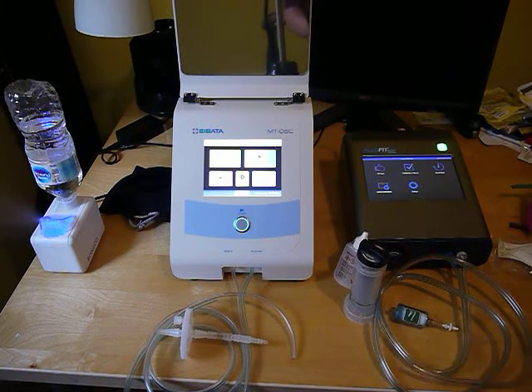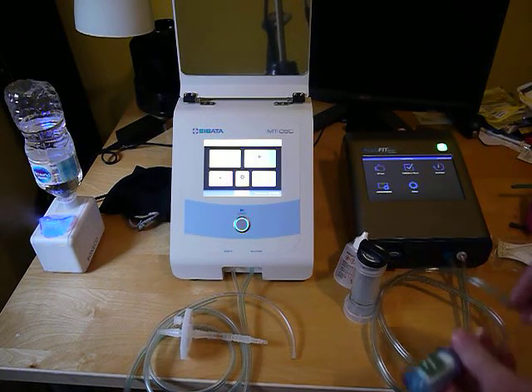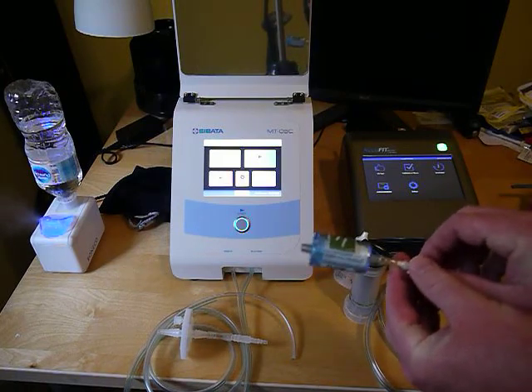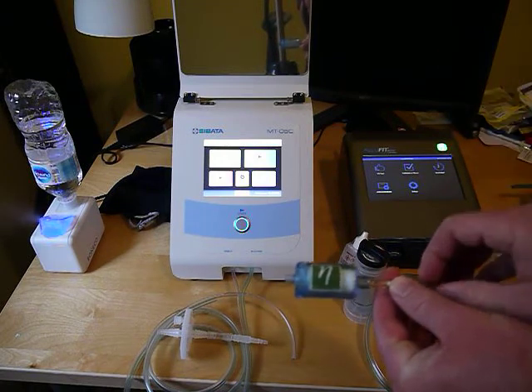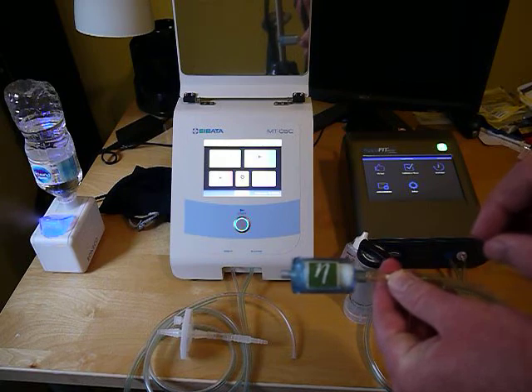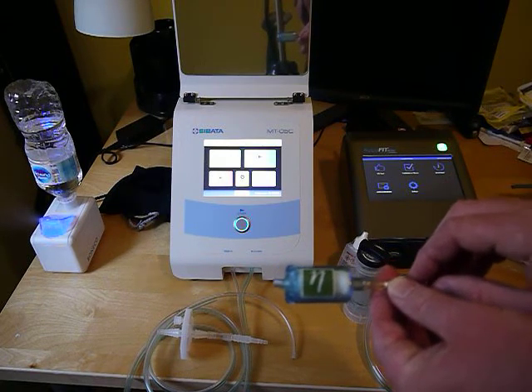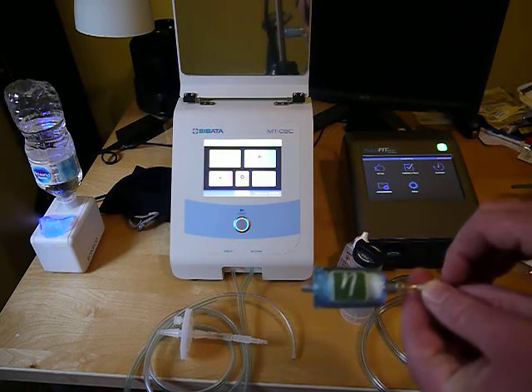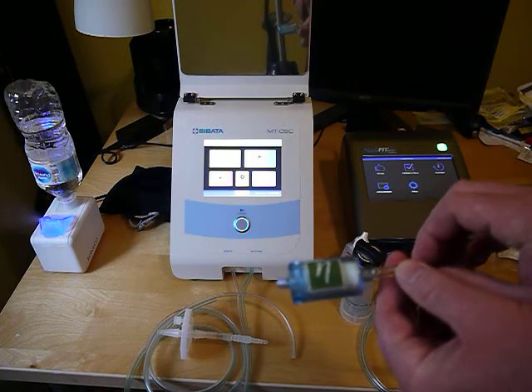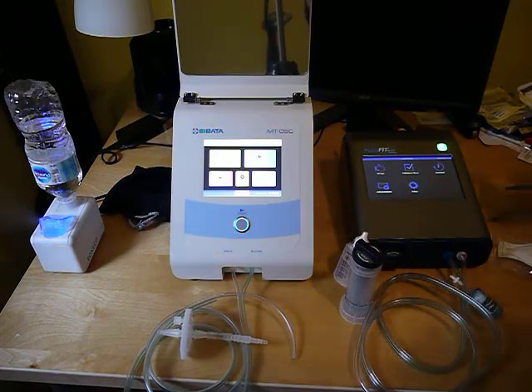If a customer is having a problem getting people to pass, one thing I'll ask them to do is put the HEPA filter directly onto the unit and fit test the filter — it's just like having someone hooked up with a mask, but it should pass. If it fails with the filter, then you know something is wrong with the machine, like maybe it's leaking or the alcohol is bad. If it passes with the filter on, then you know it's something with the mask itself.